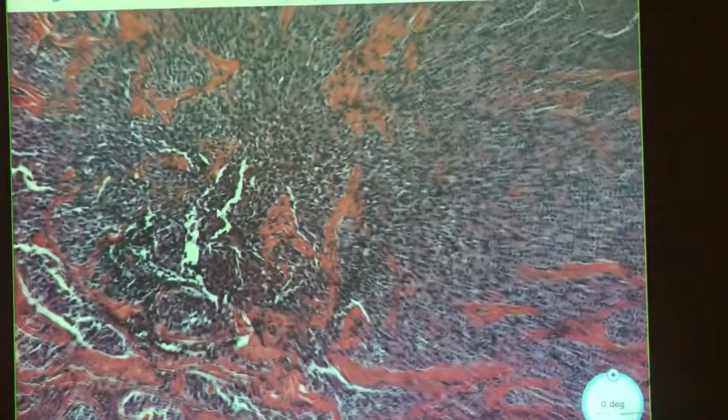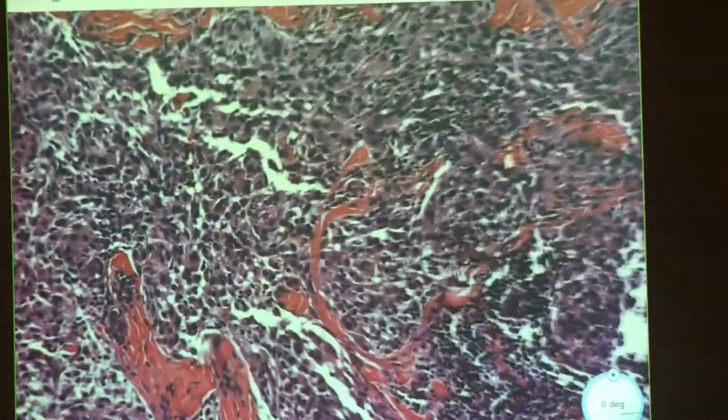And this is our last case for the day, case 10. Alright, so by low power these all look similar. Yeah, I think it's the same section. Yeah, this kind of looks like a little squid though. Mm-hmm. Alright. So, oh wow, okay. Very cellular in this area. Yes.